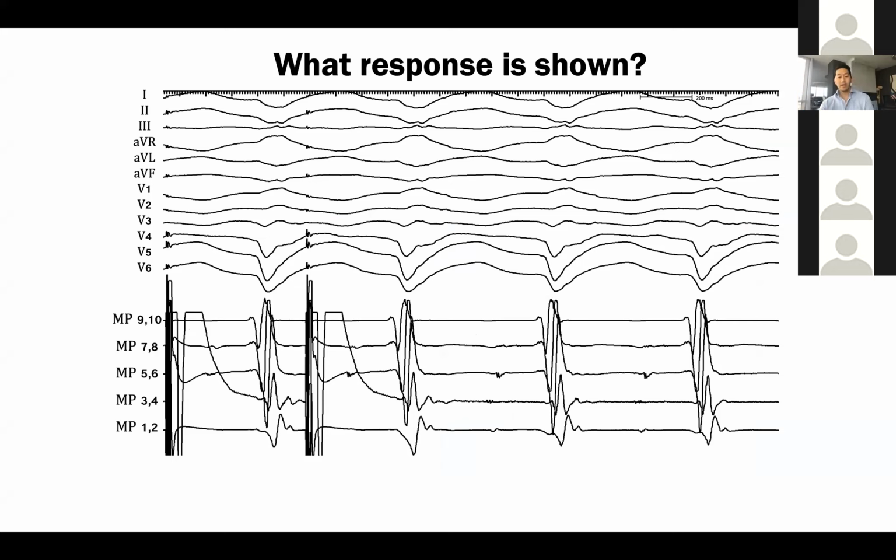Okay? Here is another example of a bystander using neighboring electrograms, concealed, step 1, step 2. I'm trying to figure out what's actually captured. And then here we have the multi-electrode catheter. And then this is MP34, which is what we're pacing from.